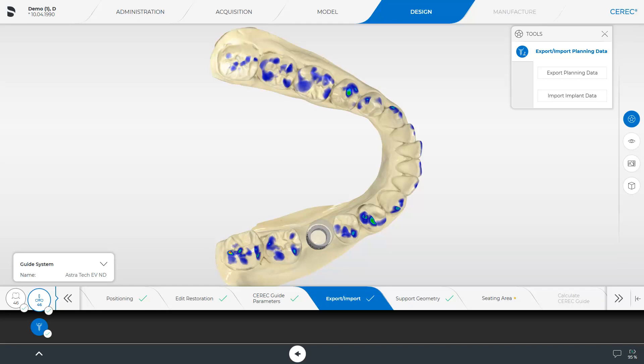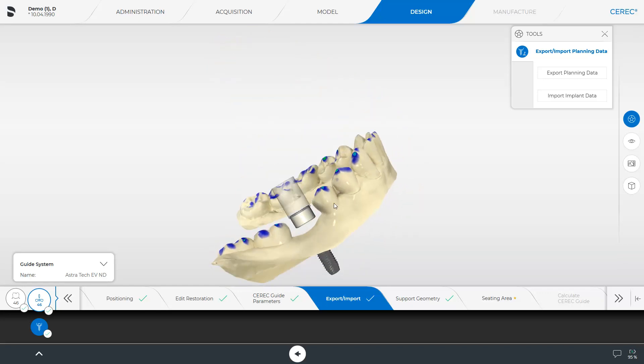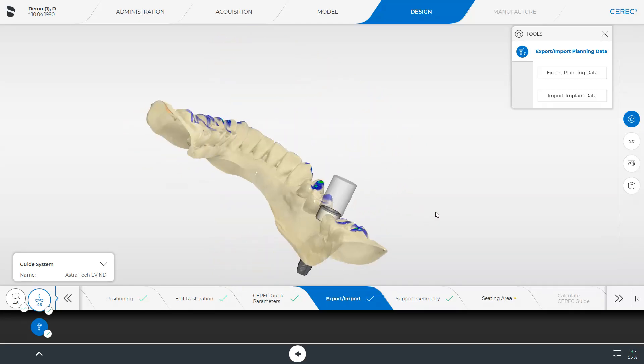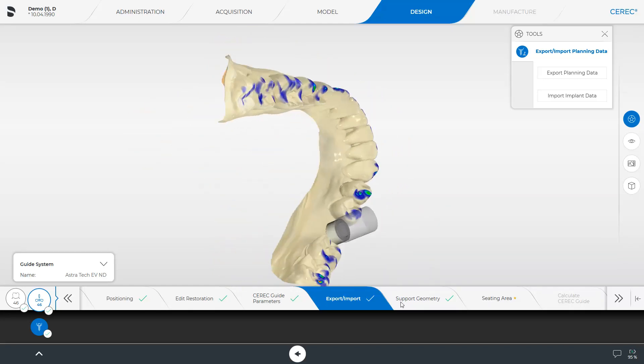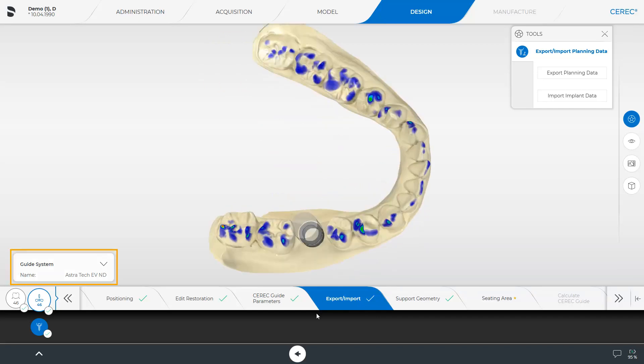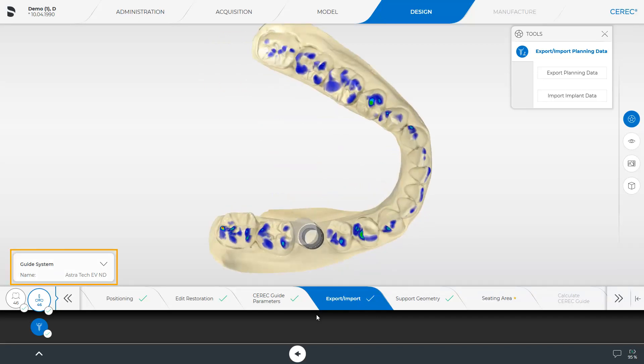You now see a cylinder in position 4-6, representing the position of the sleeve in the surgical guide. First, we will take a look at the lower jaw from different angles. At the bottom left of the screen, you get confirmed which implant type and which guide system is planned. A correction of the implant system or the surgical guide to be planned can only be made in CEREC Implant.